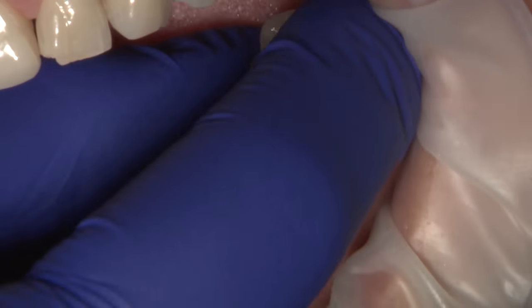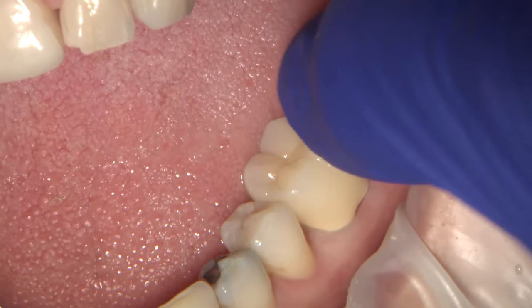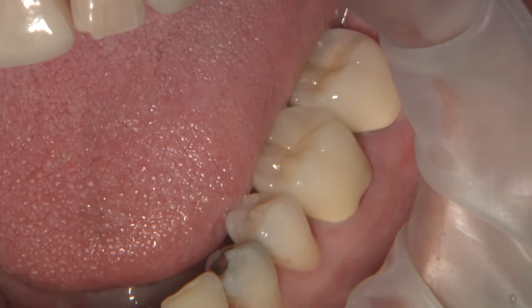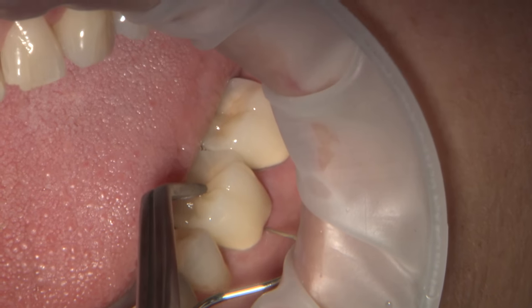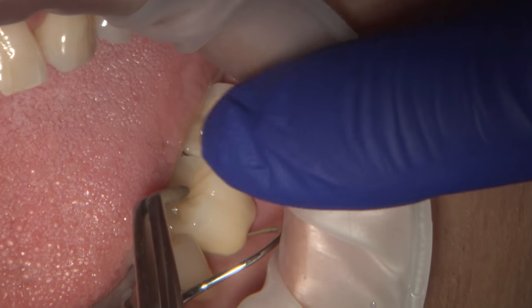Here we are trying in the crowns before final cementation. After checking the contacts and inspecting for proper seating, I will use an explorer to feel the margins to ensure there is no catch and margins are well sealed.